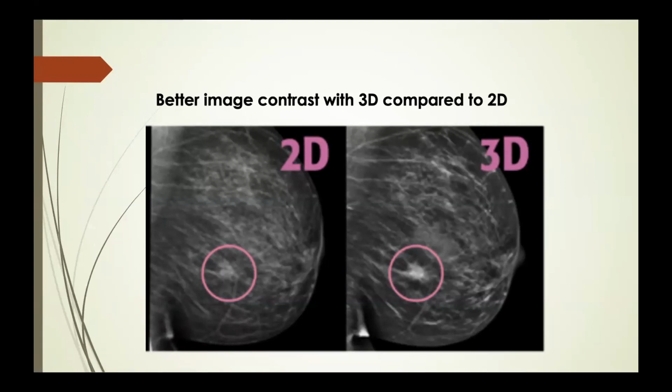is they will go ahead to do a biopsy. So this tissue that's encircled now, for example, they will do a biopsy. They will extract that tissue and take it to the lab to check whether it is a cancer or not a cancerous tissue. So mammography helps us to see this.